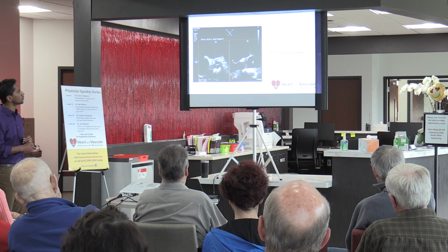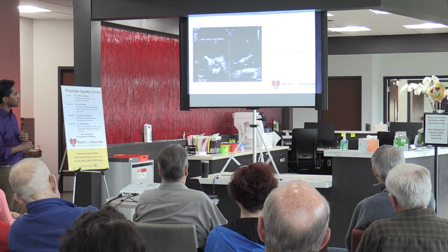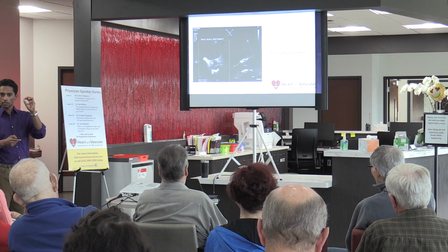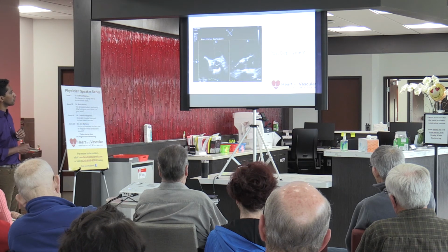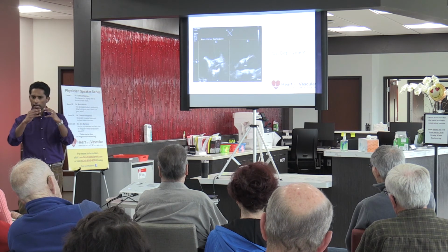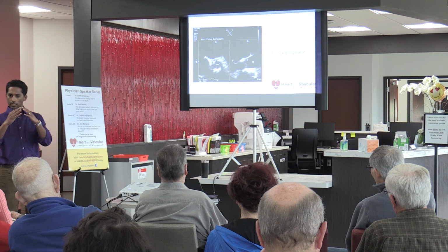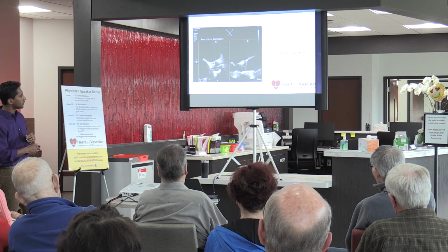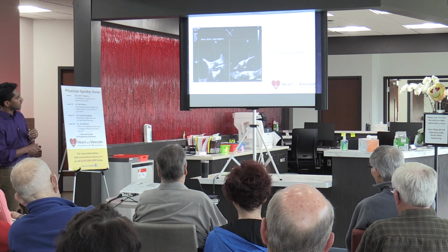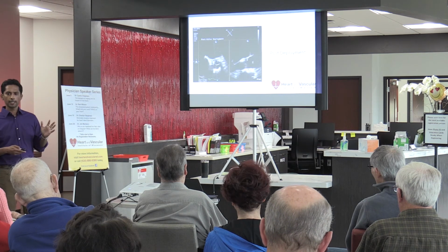And once it's done, right, this is a picture after the valve has been deployed. As you can see here, these bright streaks are from the metal struts on the stent of the valve itself, right? I showed you the picture before of what aortic stenosis looks like, right? It's these very thickened, calcified leaflets, but you can see here the new leaflets are very thin and crisp, and they come together very nicely. And so as soon as it's replaced, just minutes after the new valve has gone in, it's already working. And this is just a different view of the same, where here you can see the leaflets open and close, they're these thin, crisp leaflets. Questions about any of that?